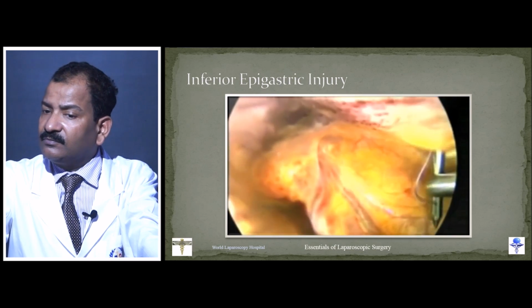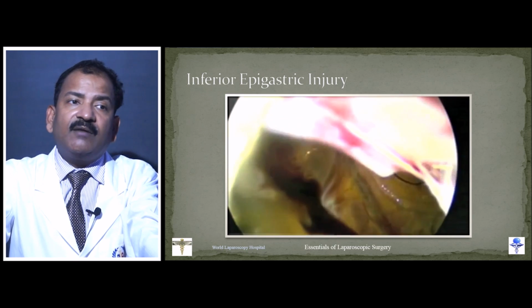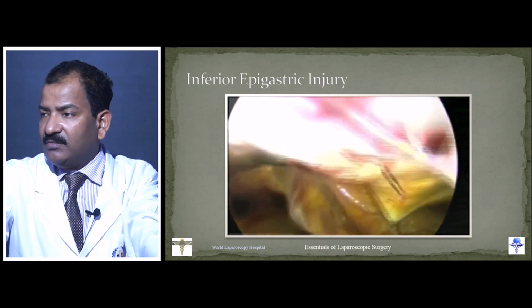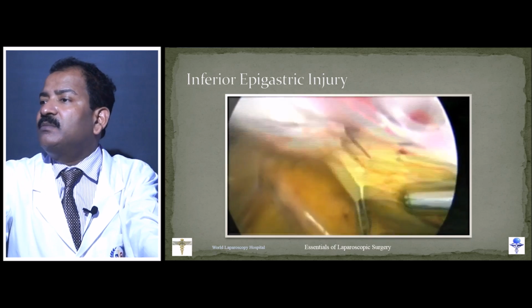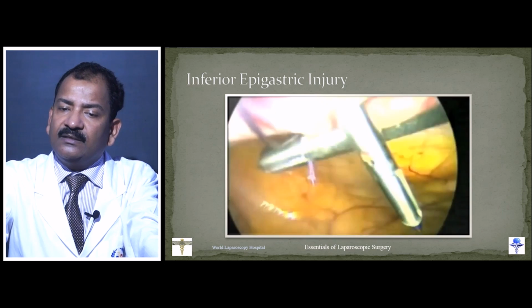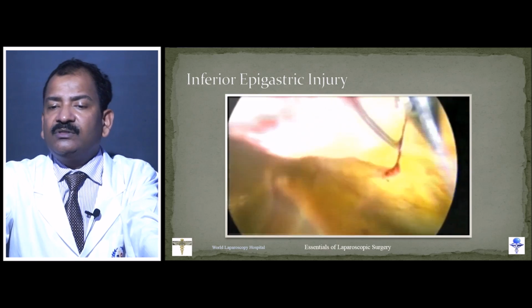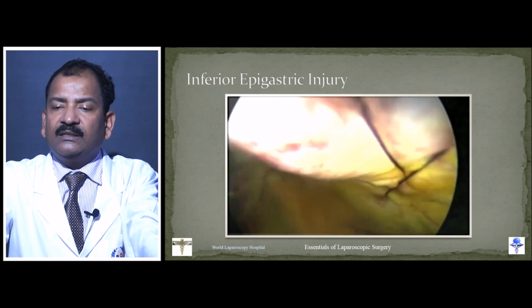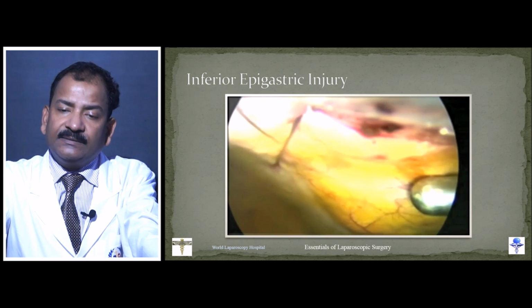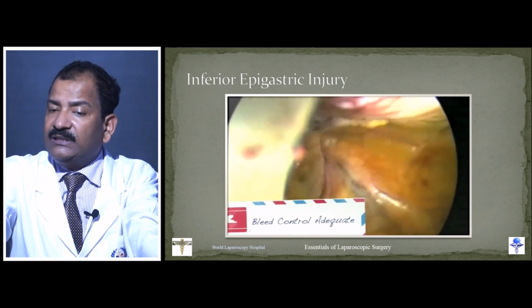In suturing this, should we go through the skin or through the... No, through the rectus. Skin should not be included, otherwise it will not give you that much pressure and you have to cut the stitch. But if you leave the skin, it will be absorbed on its own. So, this is now taken, and again the other side. It requires a lot of effort to pull it and then give pressure over the abdominal wall and then tie it. So, ideally we should not make this type of mistake.